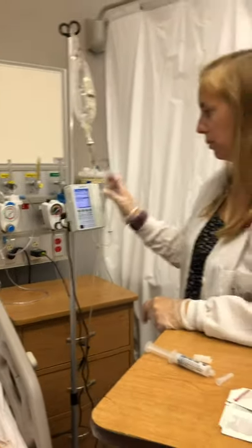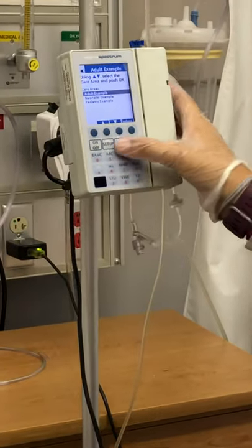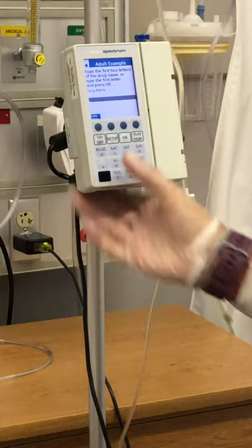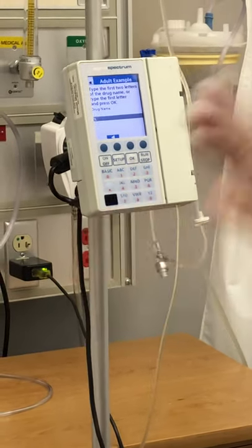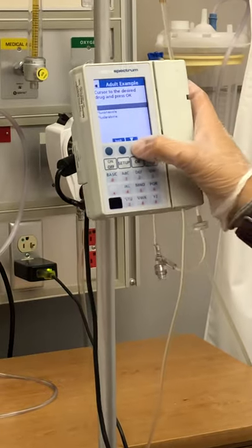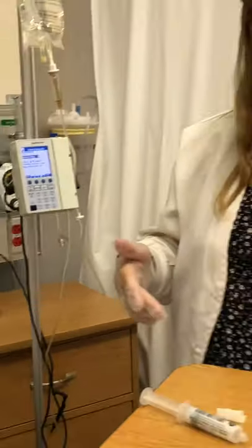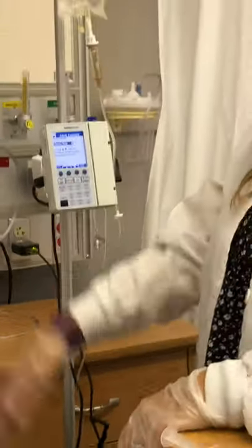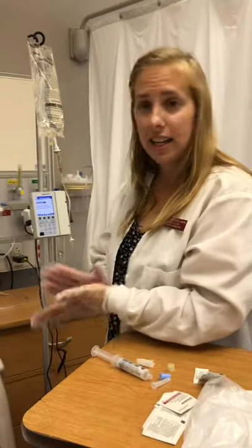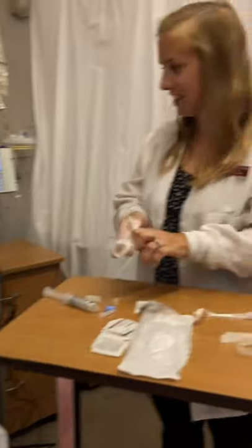I'll go ahead and program my pump — it gives you prompts and you just go through the menu to put in whatever you're giving the patient. You type in the fluid, and it will ask you for a rate or a medication. Do what's outlined on your MAR — it will tell you exactly how fast to run it. Then you just hit run and the patient's getting their meds. Check on them, make sure they have everything they need, and tell them you'll be back to check on them in a little bit. Document, wash your hands, and you're done.